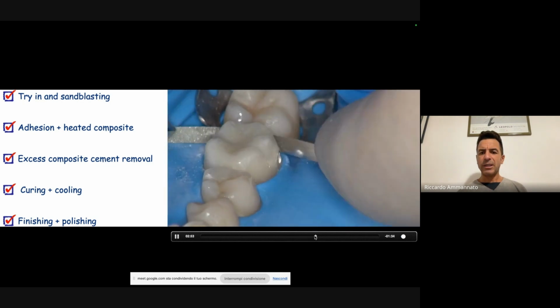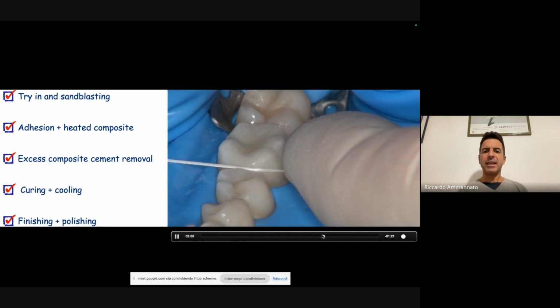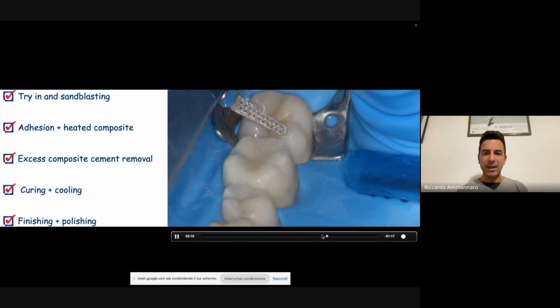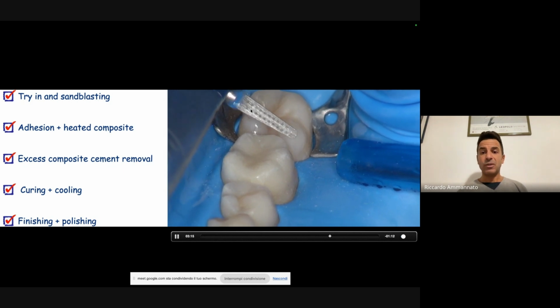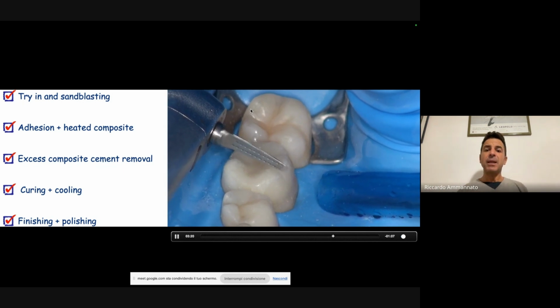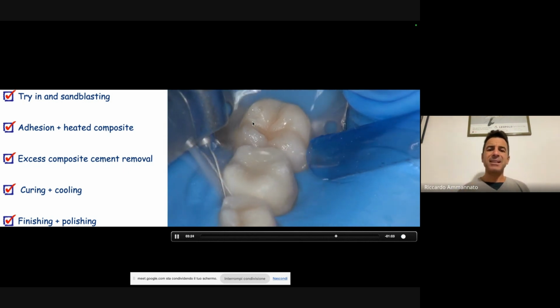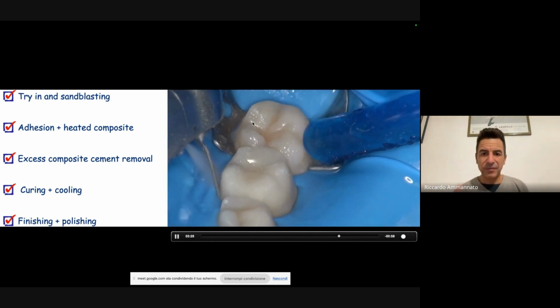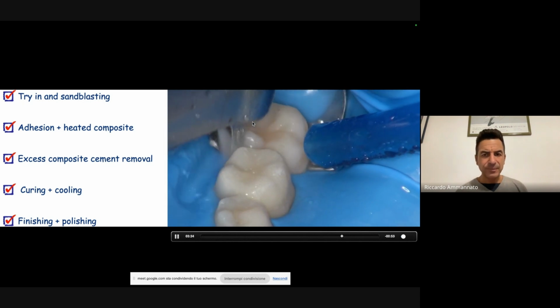Let's see if I can go a little bit forward. That is the floss that I'm checking, if it's going smoothly in the interproximal, I don't want to have any excess. This is the reciprocal handpiece that I use a lot when I do this kind of restorative, direct and indirect finishing. It has a working side and a non-working side, and it flips 360 degrees around, so it's easy, fast, and safe to do the finishing, whether we're doing direct or indirect.